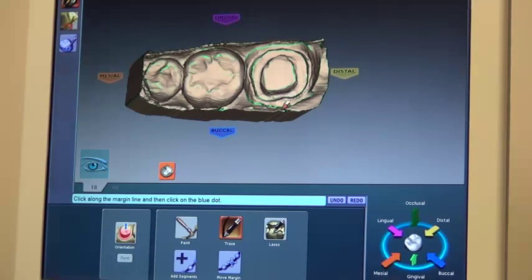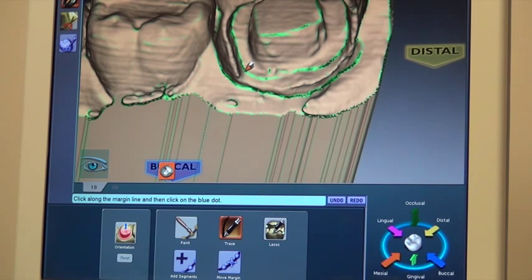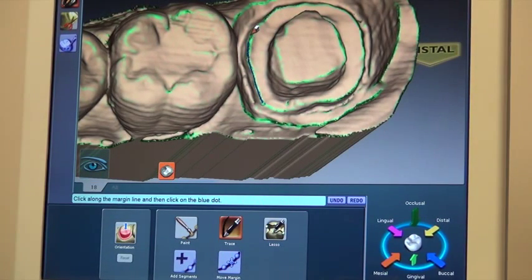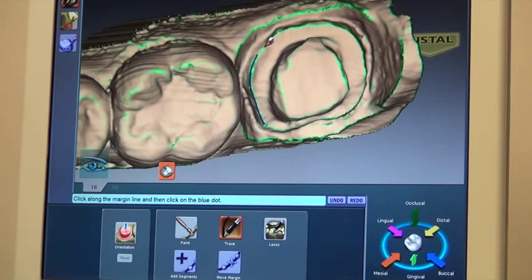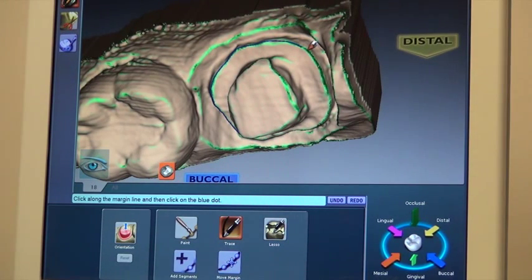We'll take our trace button and zoom in. We'll basically trace and place a series of dots on the margin — this is where we want the margin of the crown to be made on this image. We kind of just follow the margin along that tooth preparation all the way around.